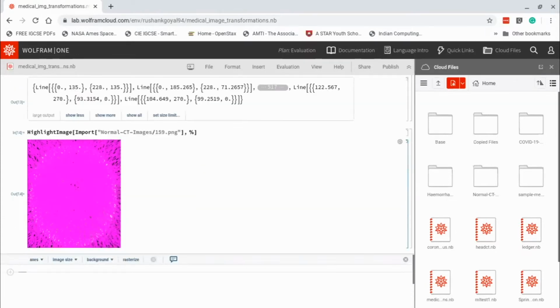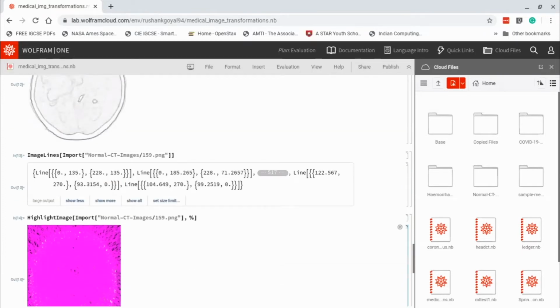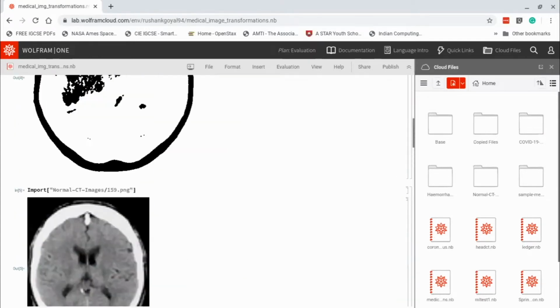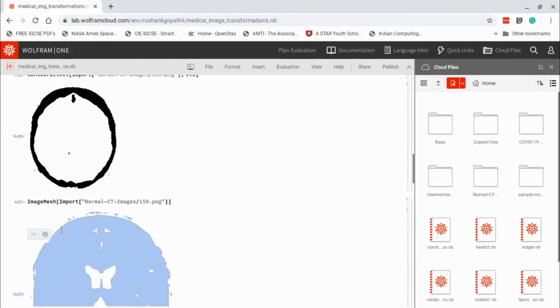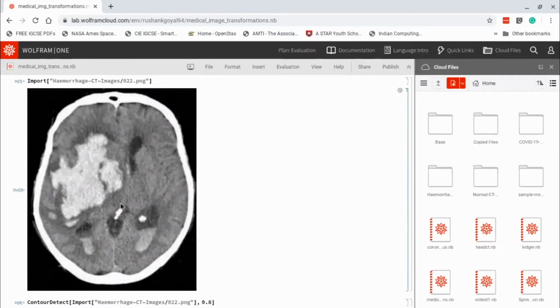So you basically have to understand how they work, and then you have to see how the algorithm could get confused, because most of them are not originally designed for medical images. So you basically have to learn how they work, and then you have to use them accordingly. So as you see, we started from this image, which is kind of clear to understand, but it has a lot of noise. And if you see other images, then there can be a lot of variations.